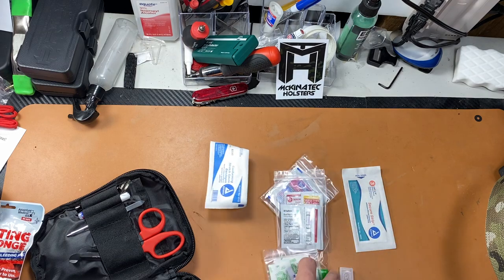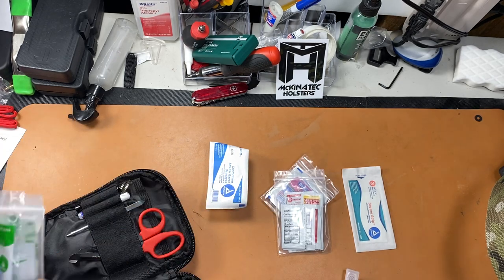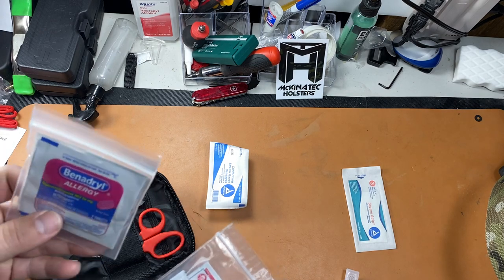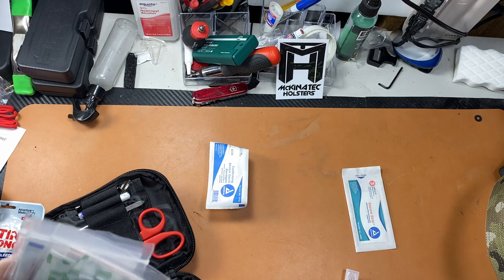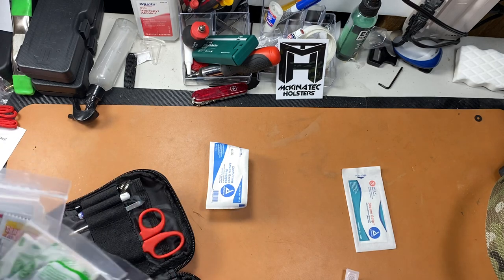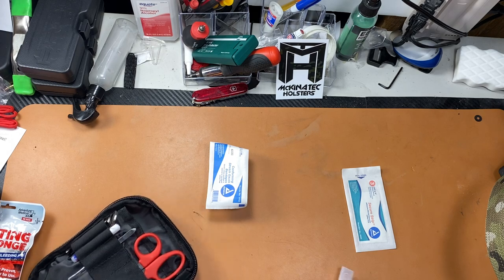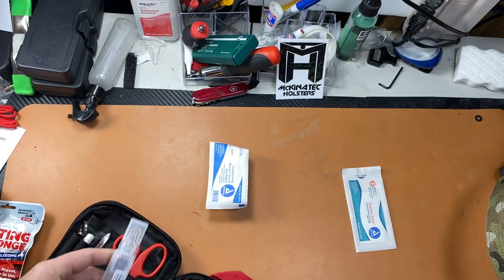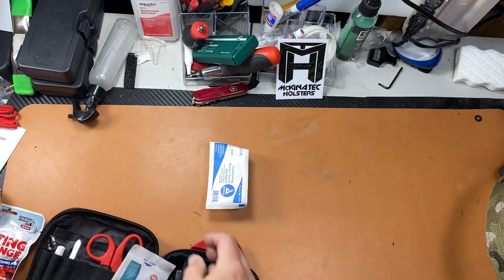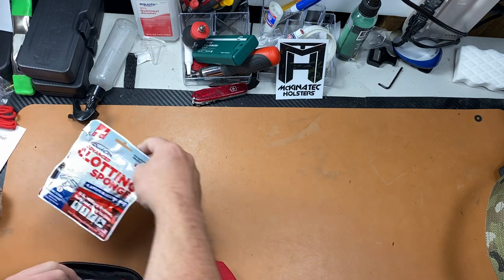A lot of the things that come with the kit are really high quality. Unlike a lot of individual first aid kits that give you generic junk, this has name brand medications, everything is completely sealed — I've gotten kits with unsealed gloves before, which makes no sense. You don't often see sodium chloride in first aid kits, and you do get Steri-Strips even with the basic kit.